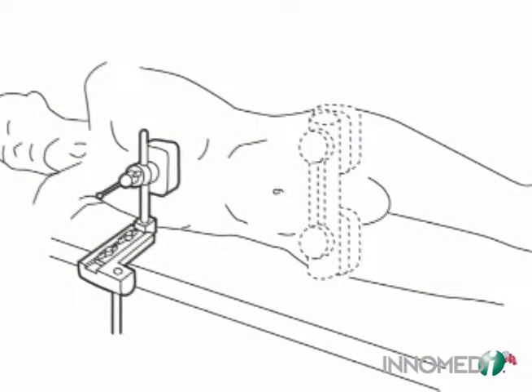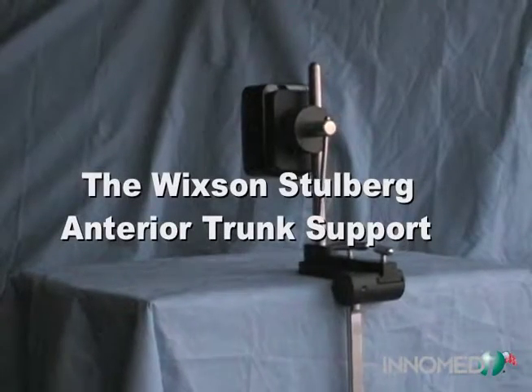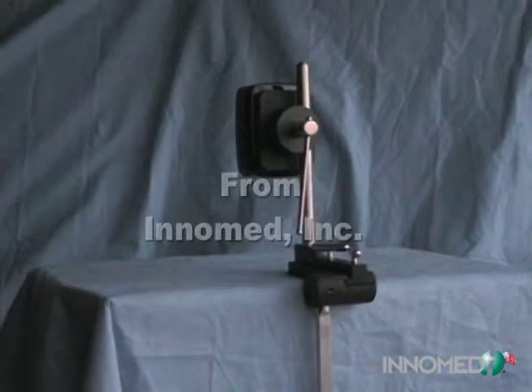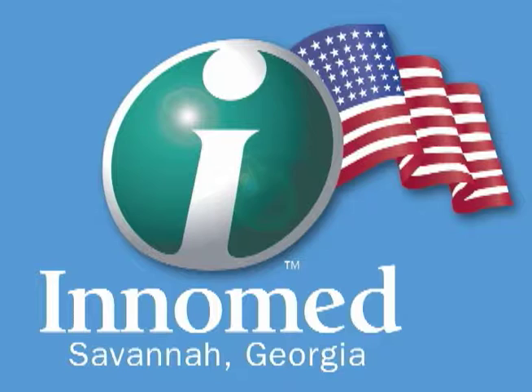The unit is attached to the operating table at a location to help support the patient's anterior upper torso. The entire unit, except for the pad, is autoclavable. Replacement foam pads may be purchased separately.